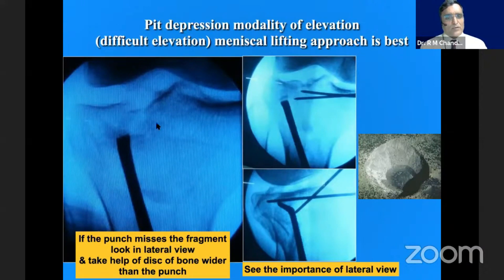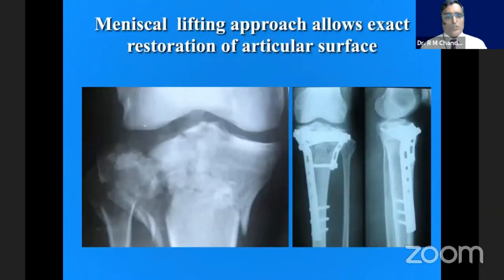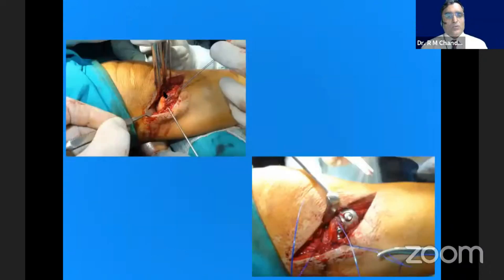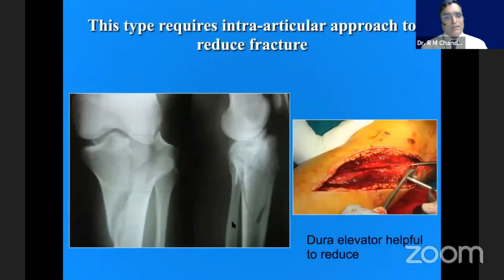In one difficult depression with multiple fragments where the whole thing has caved in — not as one fragment — we can use a meniscus lifting approach. Tie the meniscus with a couple of sutures, then look into the joint exactly and elevate the multiple fragments. You can see from the lateral side. Have a small distractor across the joint, pull the leg, and put the fragments back into position. With rafting screws and plate, you can really elevate and fix that very nicely.